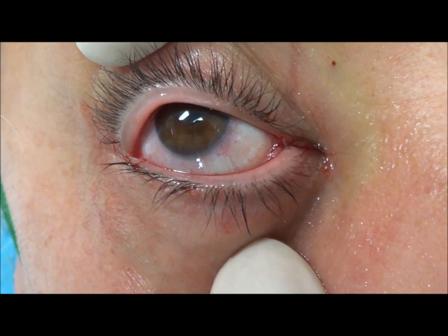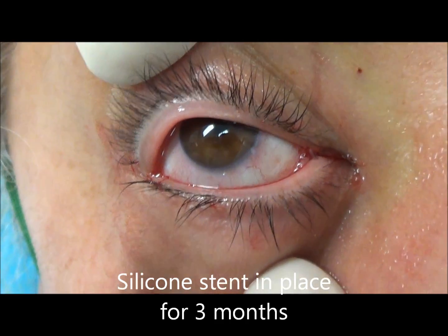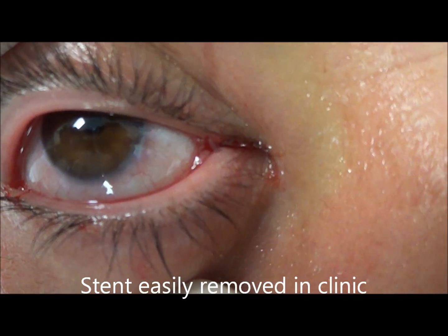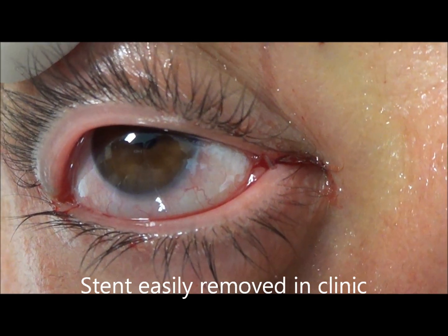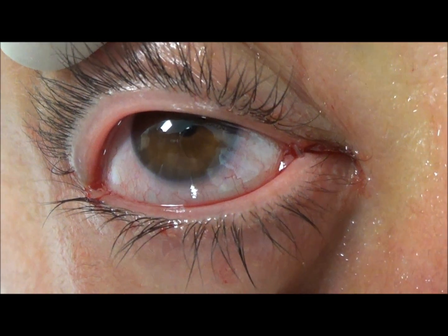This is what the surgery looks like after the operation. You can see in the corner the little tube between the top and bottom lids. That little piece of silicone tubing looks like spaghetti between the upper lid and lower lid, and this continues on into the nose. We'll take it out after about three months.